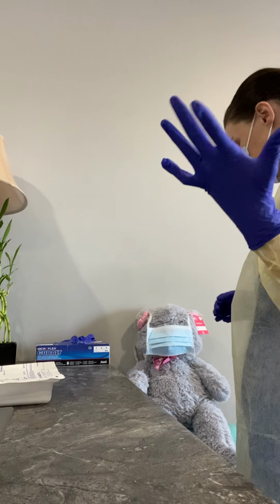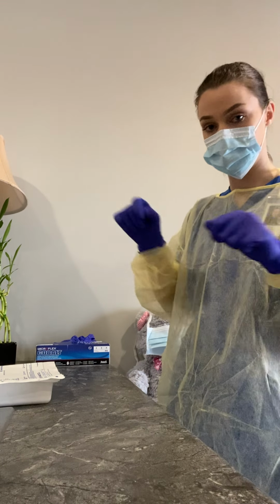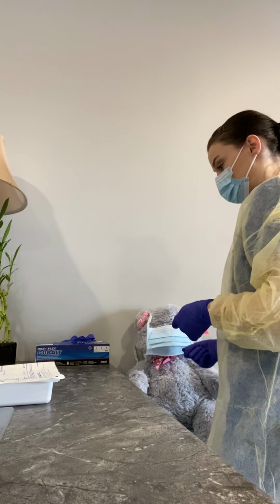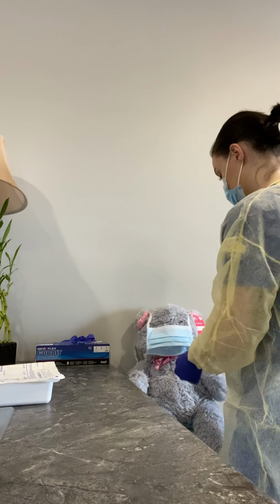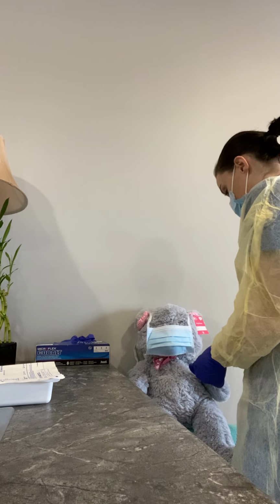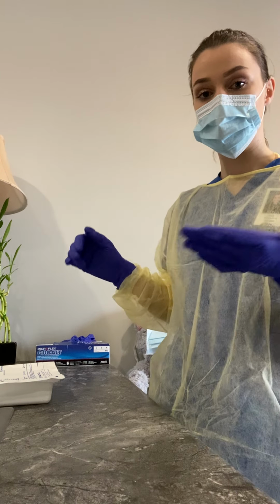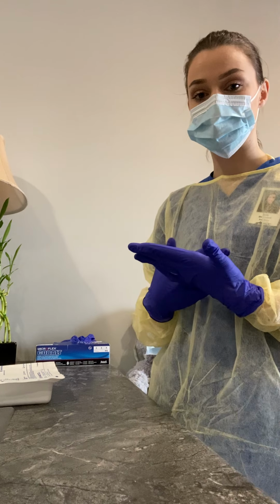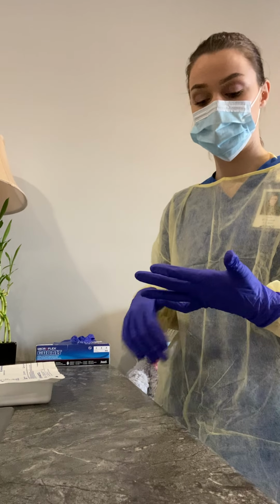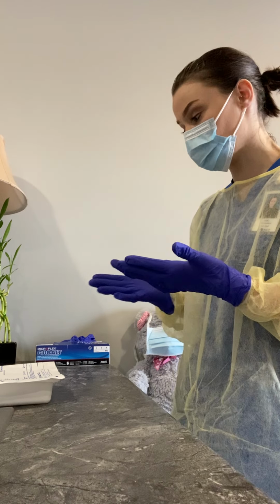Okay, so when I'm taking her dressing off, I'm going to pull from out to in. I'm going to pull that off. So let's say I'm pulling it from out to in. Her head is turned away. Got the dressing off. I'm going to look at it and note any discharge, the color of the discharge, if there's odor. I'm going to assess for any infection, if there's bleeding, what the dressing looks like. So I've got all of that.